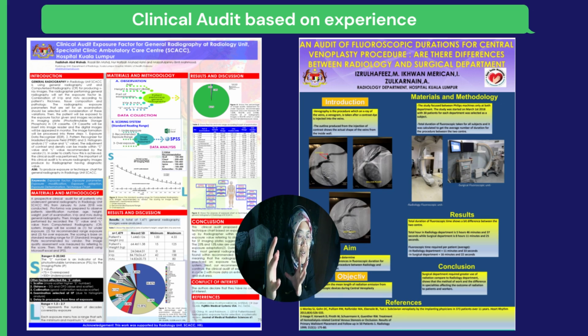This is the range of screening time, whether you can refer to the guideline from outside, whether it's acceptable or not acceptable, whether it's within the range or not. So you can compare it with other study.